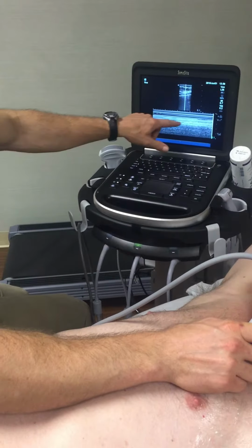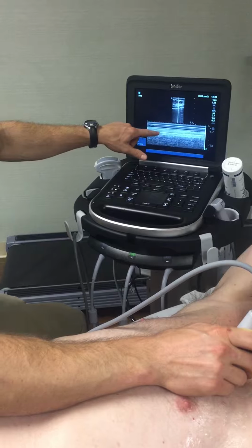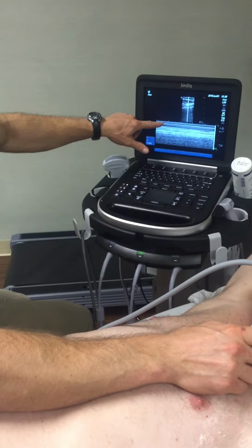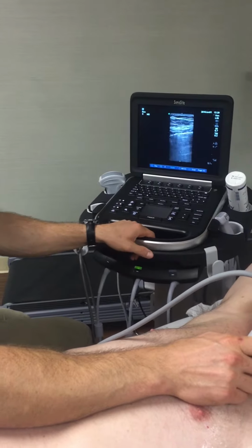You can freeze that. You can see a clear distinction between the upper and the lower. This represents the pleura here. This is the soft tissue, and this is the lung below. So that's the pneumothorax approach.